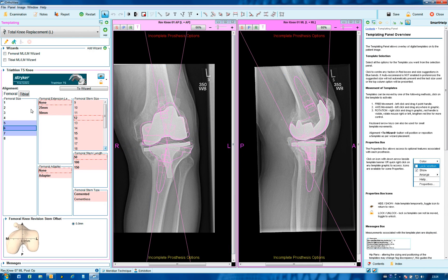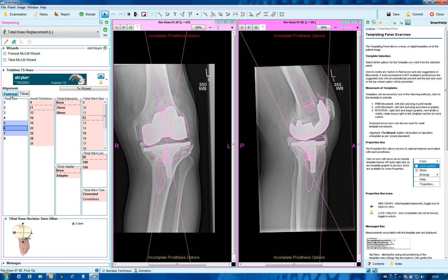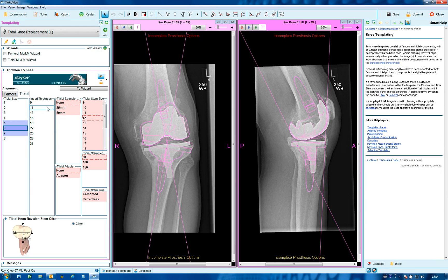Because the number of parameters associated with the femoral and tibial stems is greater than normal, separate tabs have been arranged for both stems and you can move between them. A selection needs to be made in all red boxes, and until this is done in both the femoral and tibial areas the templates will still be in the pale colour.